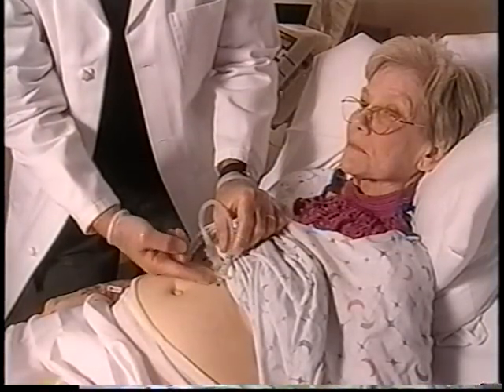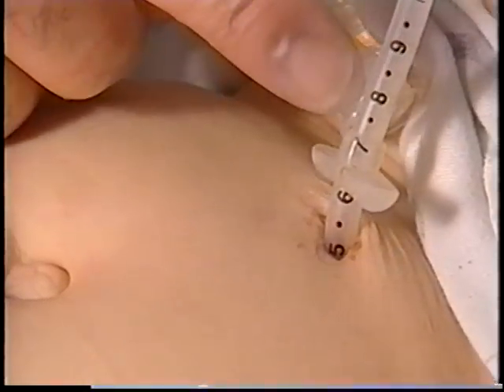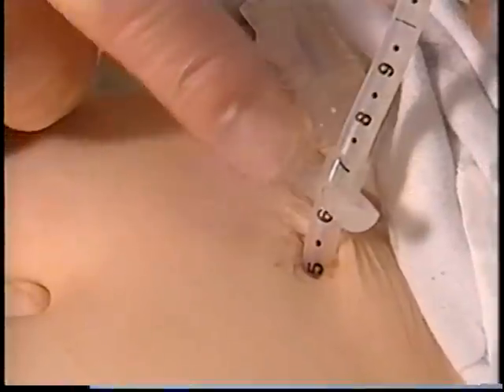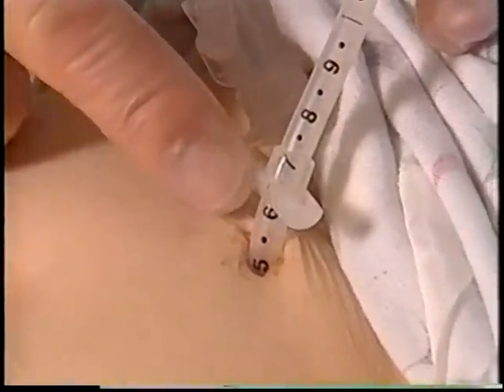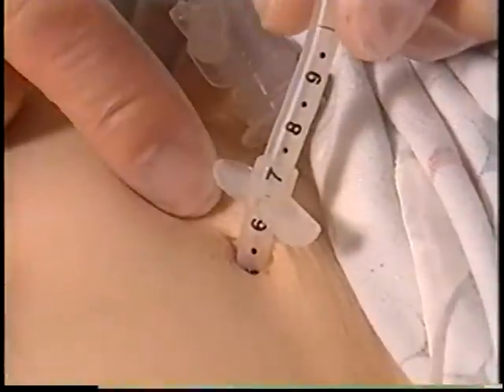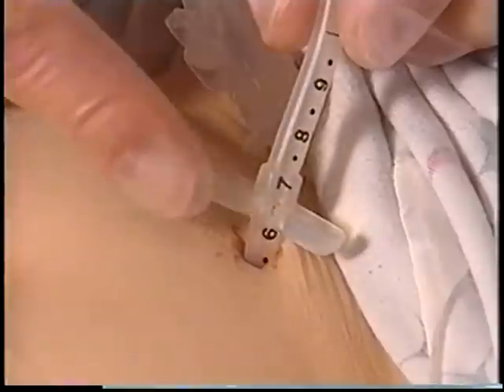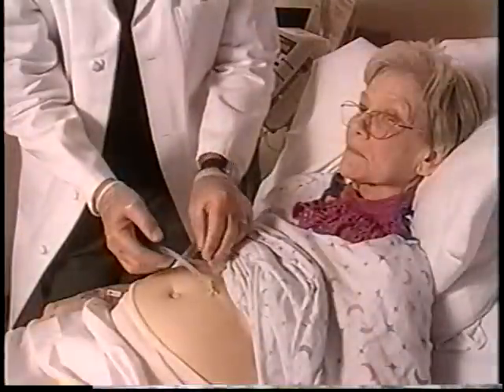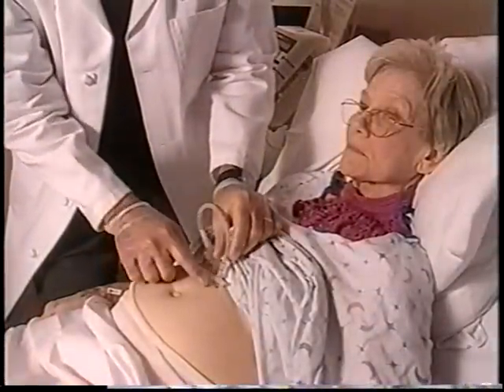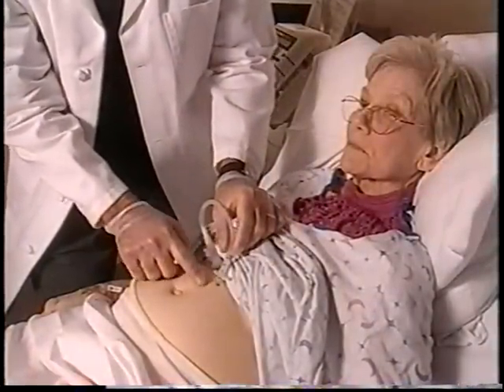When the PEG tube is placed, a notation is made of the tube mark closest to the external bolster. When stoma care is being performed, the position of the external bolster should also be checked using the markers. The bolster should be 1 to 2 centimeters away from the abdominal wall, allowing the free float of the tube that will avoid excessive pressure at the site. Checking the tube markings will also indicate whether the tube position has changed due to migration of the tube inward or outward.